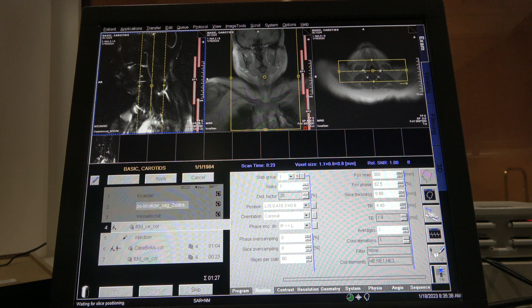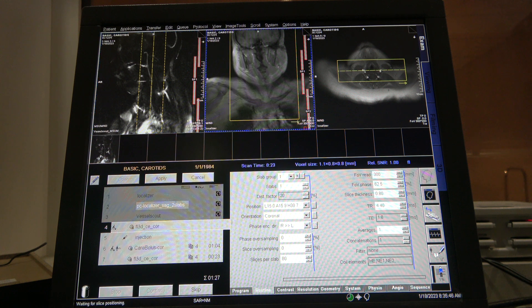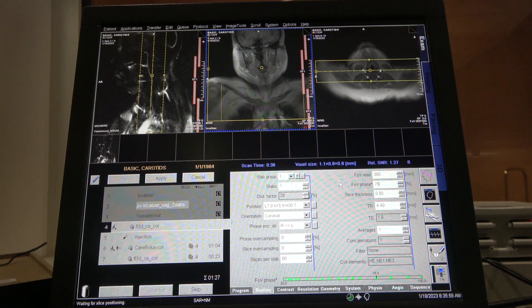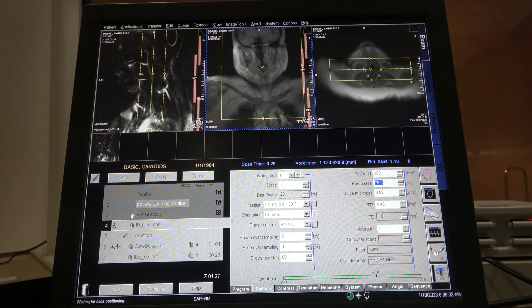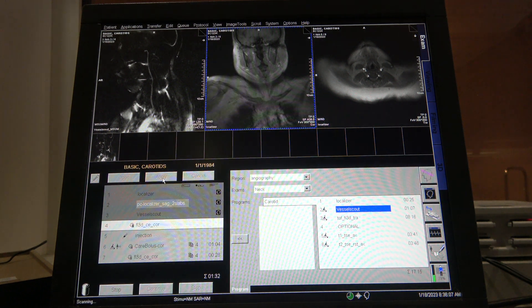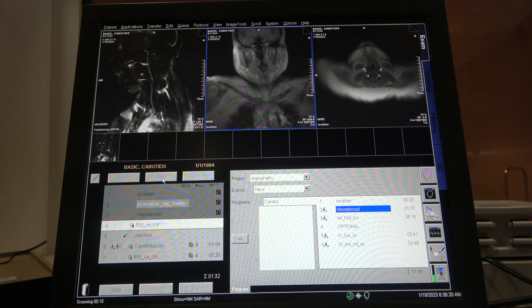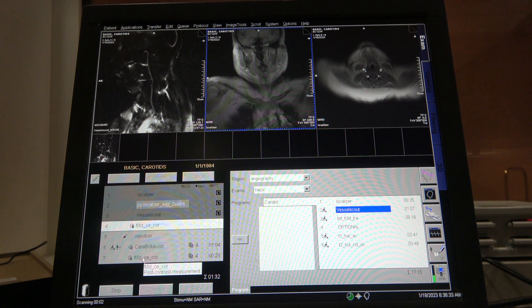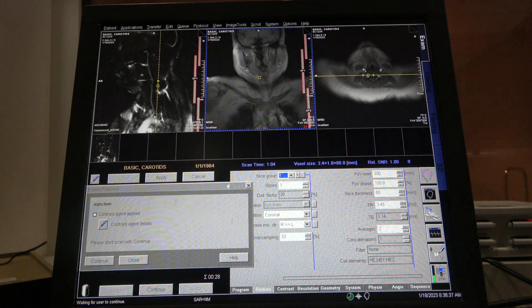Here's the one I like — here's the arch, so we can move it up a little bit. This is a pre-scan, but it copies your contrast sequence, so it's going to be exactly the same geometry. If you like it, go ahead and give contrast.